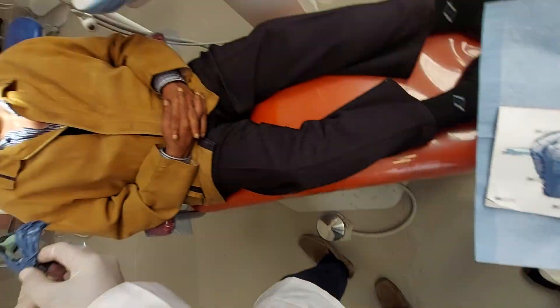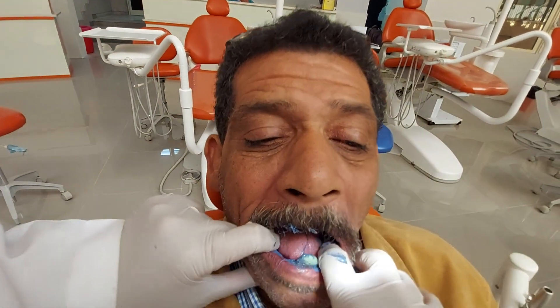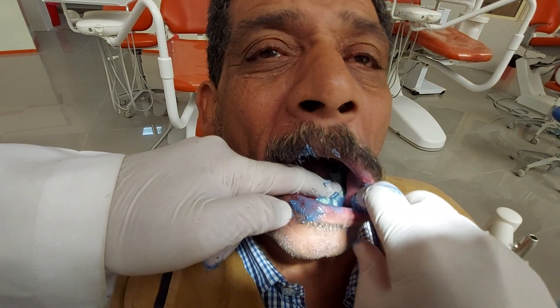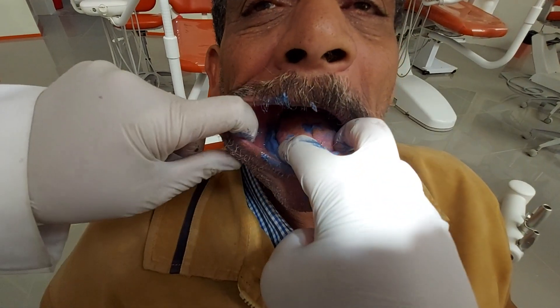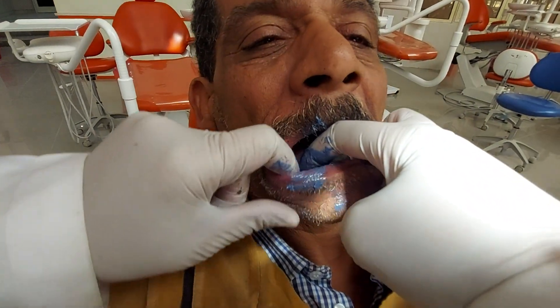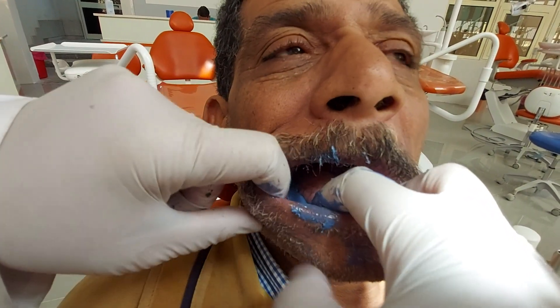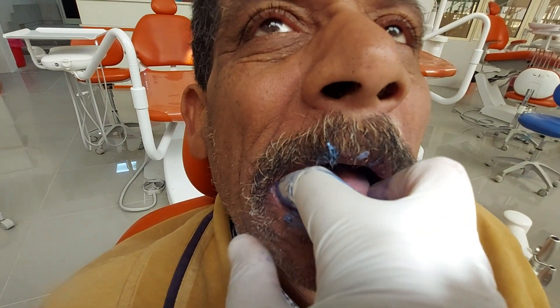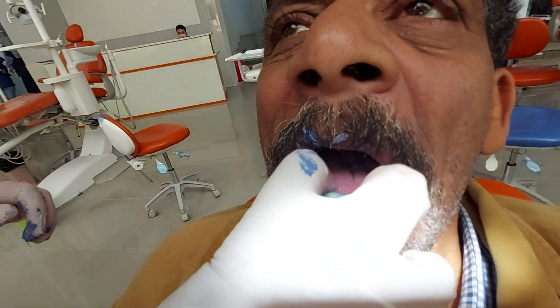I'll take the material, stand in front of the patient's mouth, rotate the tray, insert the tray inside the patient, and start border molding slowly and slightly. For the labial part: upward and inward; for the buccal: upward and inward on both sides. Then I ask the patient to close against resistance.